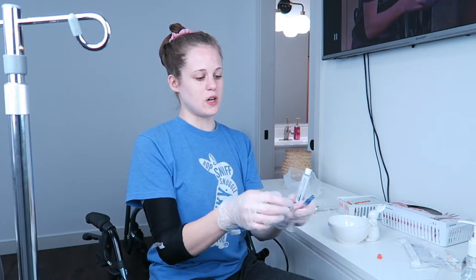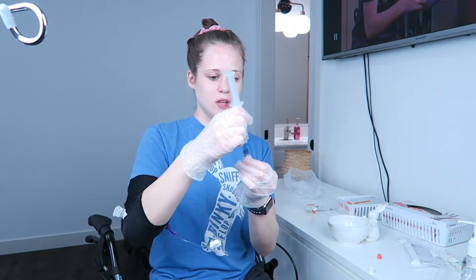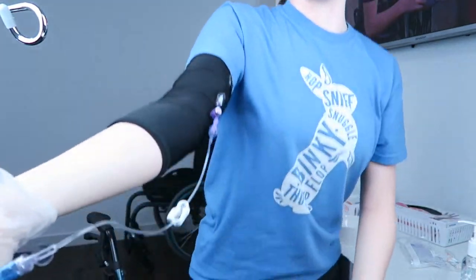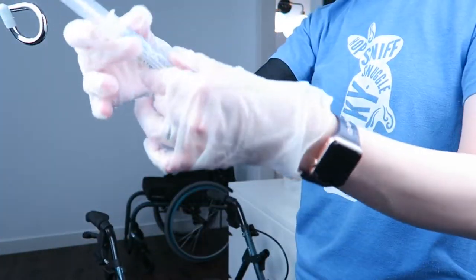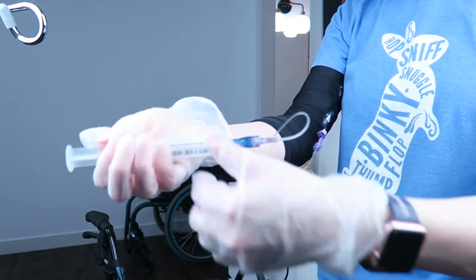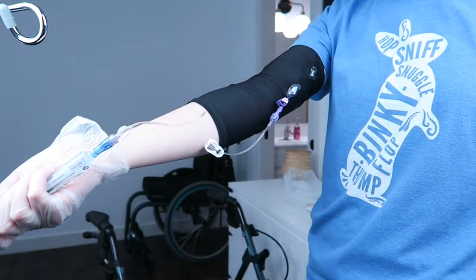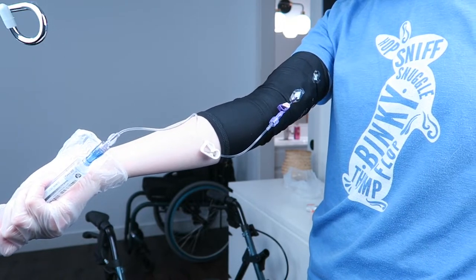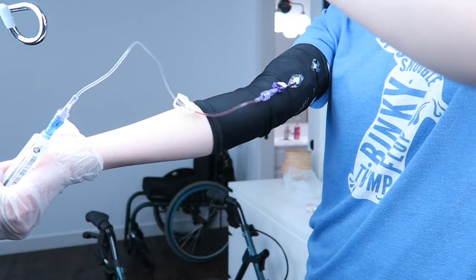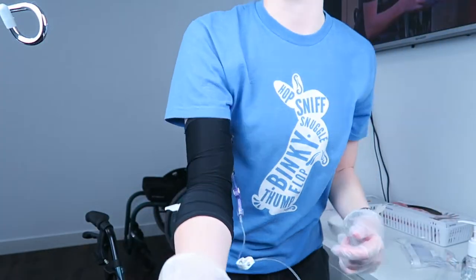Then you're going to take your saline flush and put it on the end of the clave connector. Now for this part, I'm going to stand a little closer to the camera so you can see. This is the saline flush, and how you check for blood return is you take the syringe and pull backwards instead of pushing down. So I'm just going to go ahead and do that. As you can see, the line here has blood in it, and that is what we're looking for. If you can't get blood return, that means that you have a clot in your line.